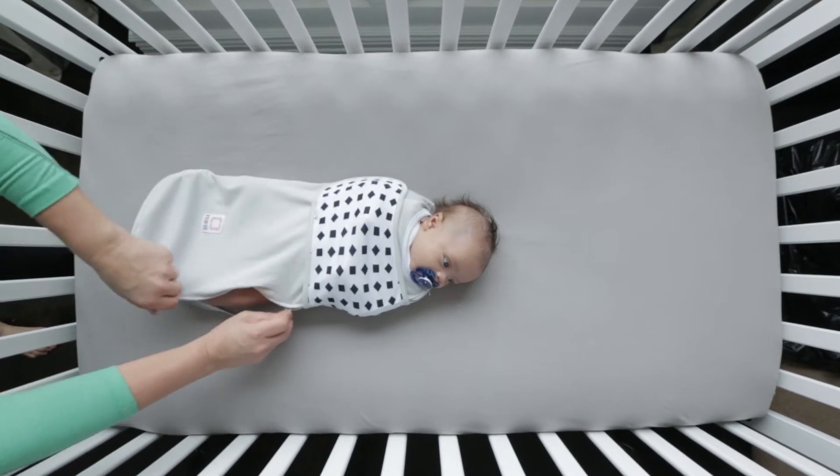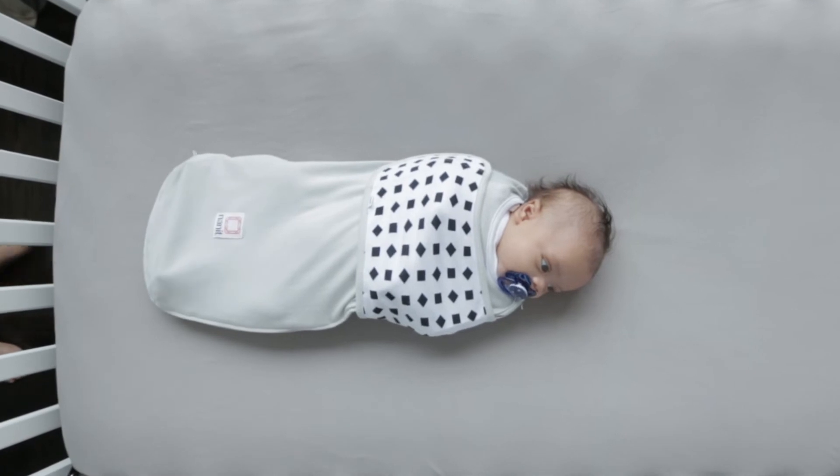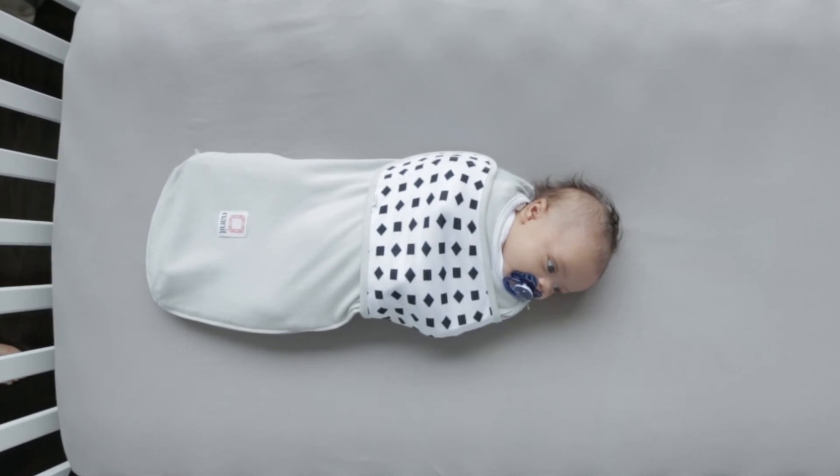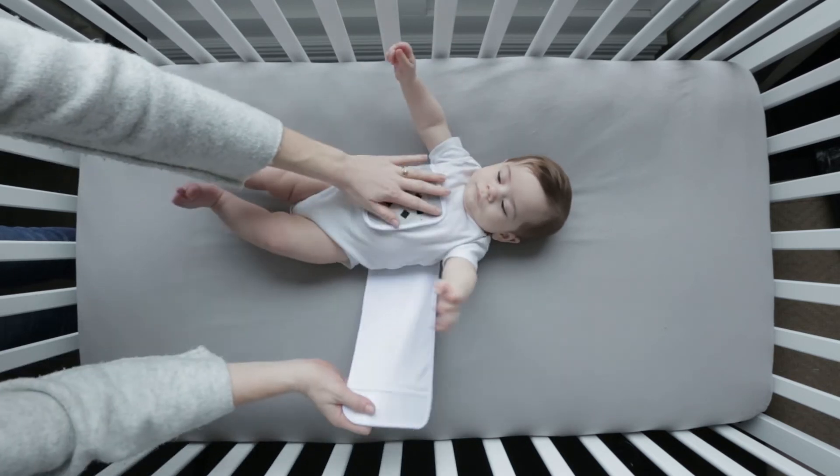The Nanit Swaddle is designed for babies who sleep on their backs and are not yet rolling over. It's perfect for newborns who love the feeling of being swaddled.